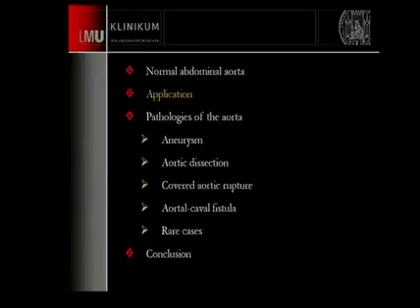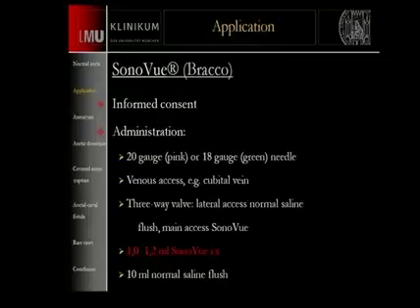But if we think about pathologies, for example the aneurysm, there we have to use contrast. If we think about how much contrast is necessary to get a good contrast, we use only 1 cc of contrast followed by 10 cc of saline solution. The amount of contrast is a little bit different on the different systems. So sometimes you need a little bit more contrast, but on average you use only 1 cc of contrast.